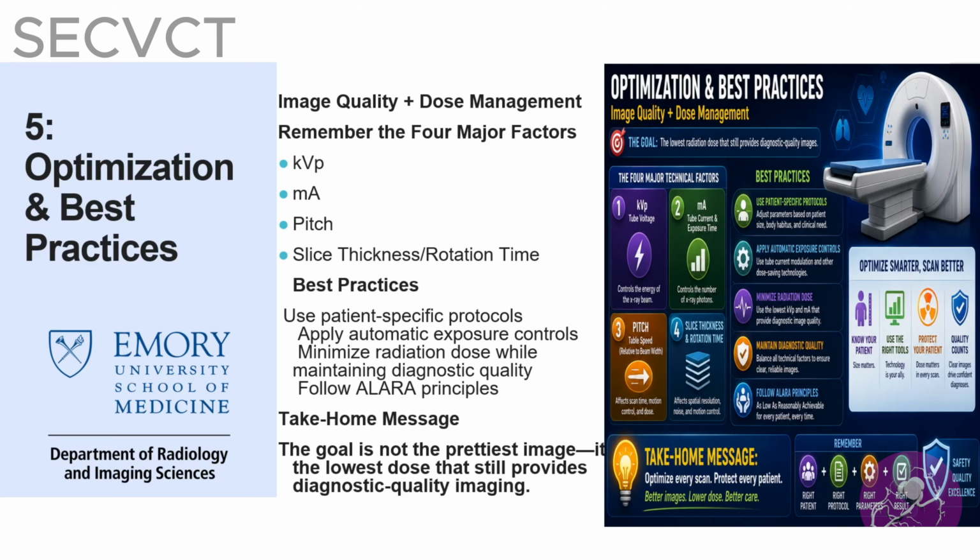Okay, so for those of us that have OCD, and those of us that have to get the best exam 100% all the time, just realize that everything is not 100%. Sometimes we have those technical factors, or those patients that can't get that arm up, or those patients that we went over breathing with multiple times, or they've had a stroke, or there are factors that we cannot control. But as technologists, our job is to do the best that we can, advocate for your patient, and get the best image quality that you can for your physician so they don't have to give that non-diagnostic reading. And with that, thank you.